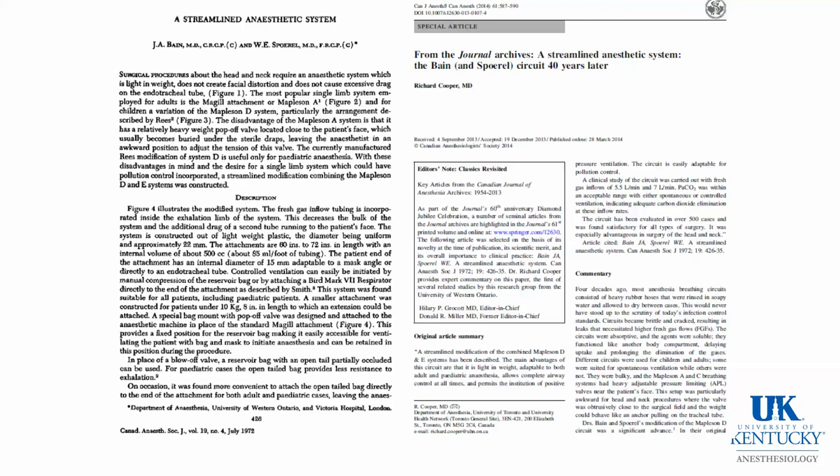Now, I want to make you aware of the fact that material management selected some other kind of system as its replacement without any discussion with the clinical users. And while it was possible to attach this system to our Bain mounts, it was not a Bain circuit and did not function like a Bain circuit, or at least there was no guarantee that it would.